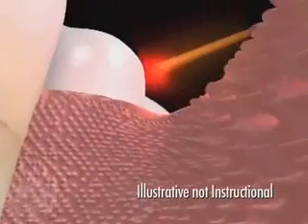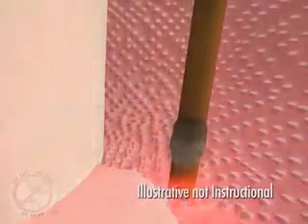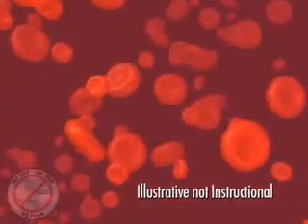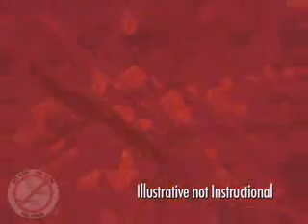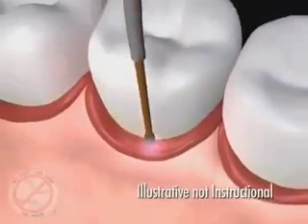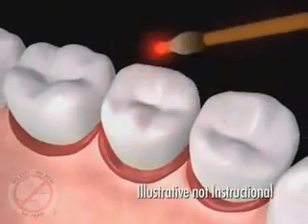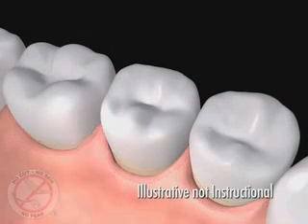Once the surfaces of the teeth are clean, the laser is used a second time at the bottom of the pocket to remove any remaining debris and to sterilize the pocket, soft tissue, root, and bone. This also causes the blood to become sticky, creating a seal around the teeth. Once the seal is formed, we have created a clean, closed, and stable environment for healing to begin. We have tipped the scales in favor of regeneration versus degeneration.